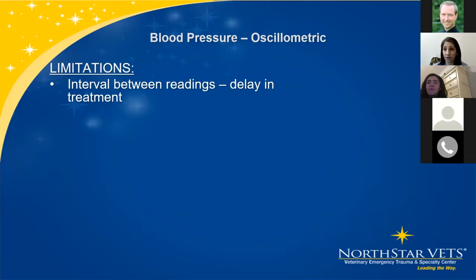Typically, every 3 minutes is a setting that maintains safety for the patient, so that the leg can continue to circulate, but it also allows the arterial pressure to resume in between those readings, so that you're getting a fairly accurate measurement. And mostly every 3 minutes is safe enough for a reasonable amount of monitoring of that blood pressure for most patients.